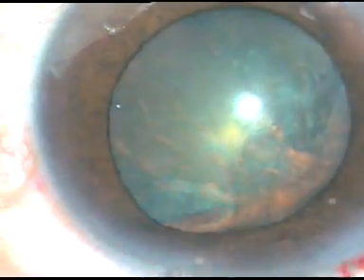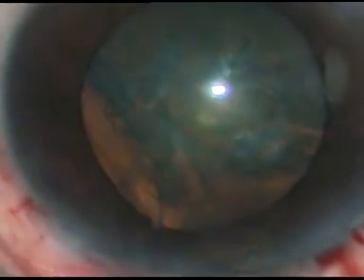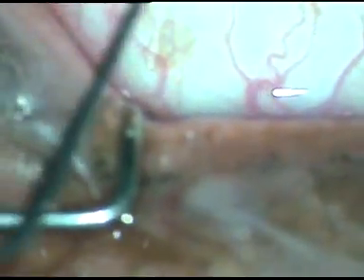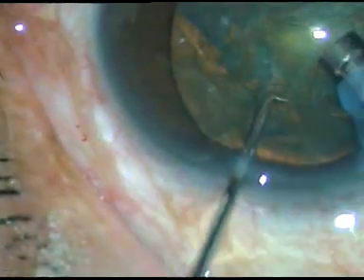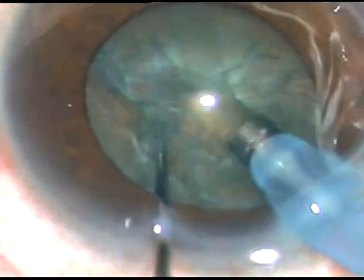Here we can see the pupil is tending to become small. Some more viscoelastic is added, and the nucleus has rotated. I go into the anterior chamber with the tip of the phaco handpiece. At this time the pupil is dilated adequately, more than 6 mm. As I go in and start aspirating, see what happens — once the pupil becomes small, the iris starts dancing.